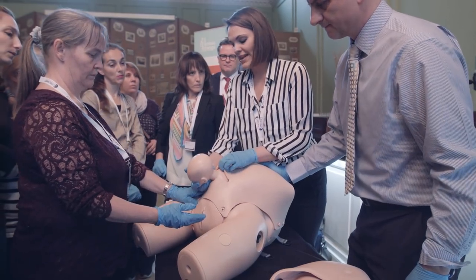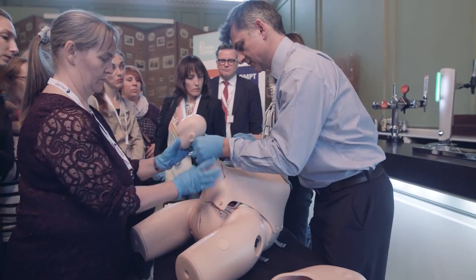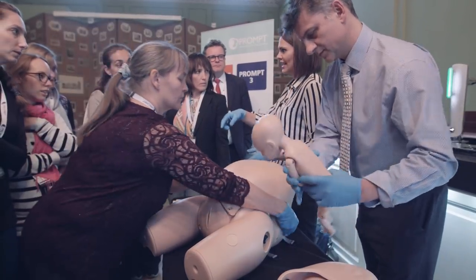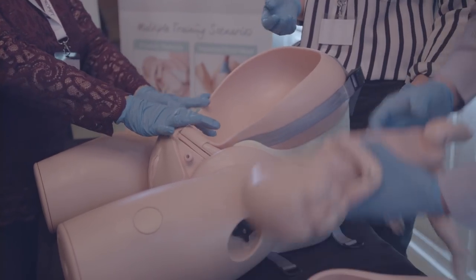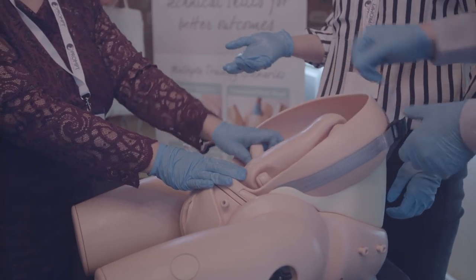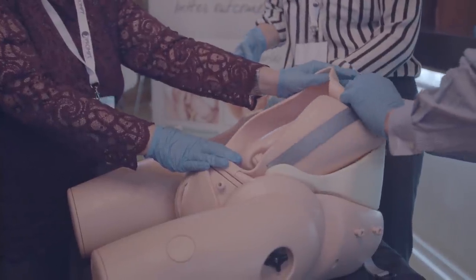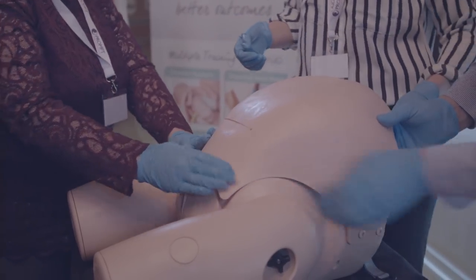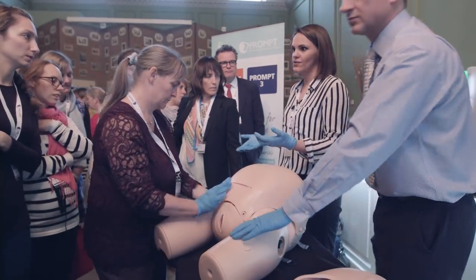People can practice delivering the rest of the head. This is a good opportunity for obstetricians to learn the technique, but also for multi-professional training, because a lot of the time it might be a midwife in theatre who's asked to do a push-up from below who's never done it before, doesn't know the position of the baby, and is feeling intimidated in a high-pressure situation. They may just put one or two fingers in and push up, and that's where we increase our risk of skull fractures. So it's really good to do as a multi-professional training exercise with midwives as well.